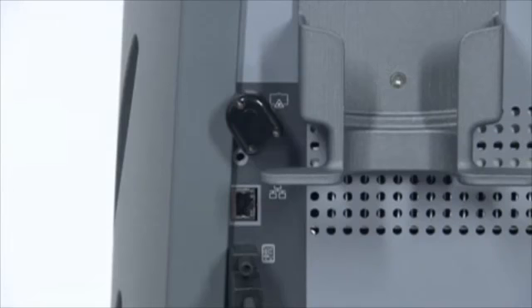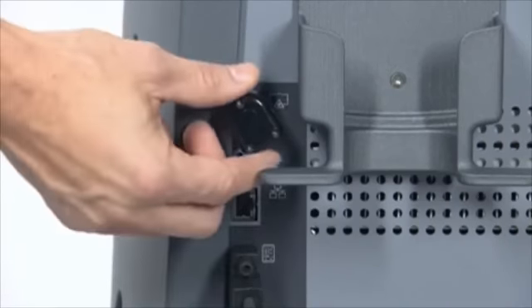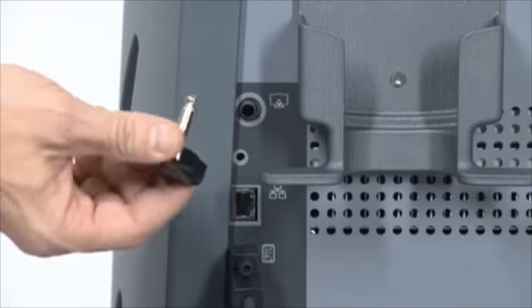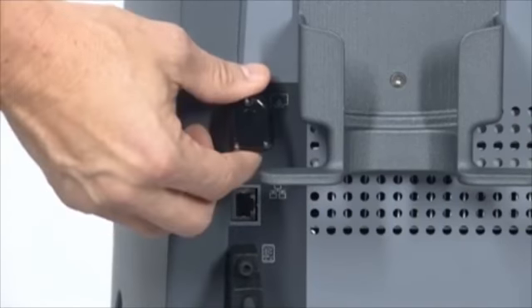The external door interlock is a safety feature that disables the laser if the treatment room doors are opened or the interlock plug is removed. The interlock can be set up with a remote switch, or an external switch can be wired to the interlock plug. Plug wiring shall only be performed by a qualified electrical professional.